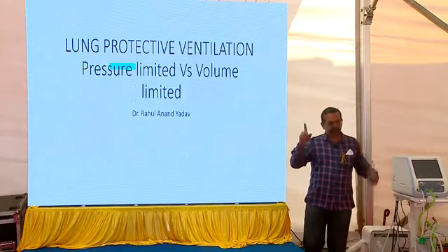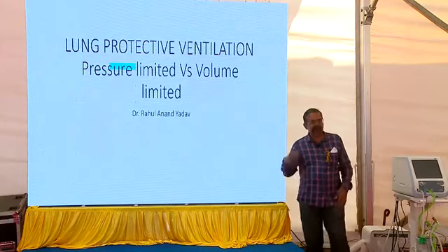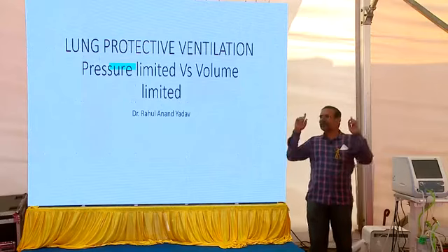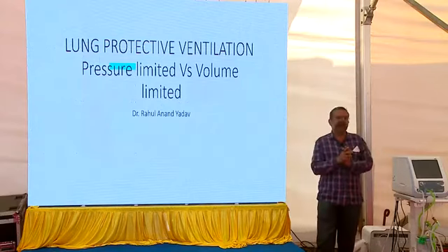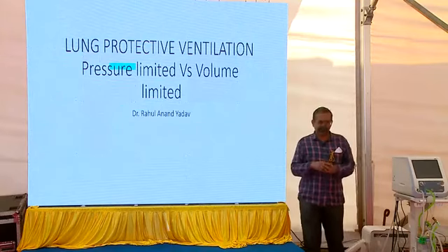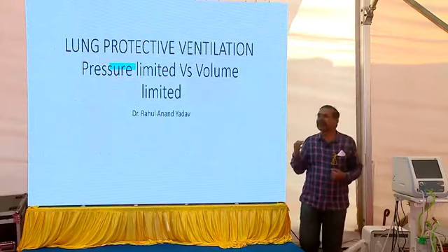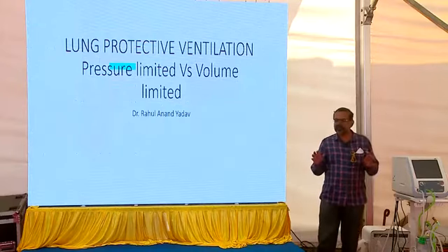All of them. COVID ventilation, volume ventilation has miserably failed. This is also true. Then I asked another friend, suppose you get mild COVID, you get giddiness, you fall, you get cerebral edema. Now very tight control of CO2 is required. Now what do you want? Shall we ventilate by pressure? No. Please ventilate by volume.